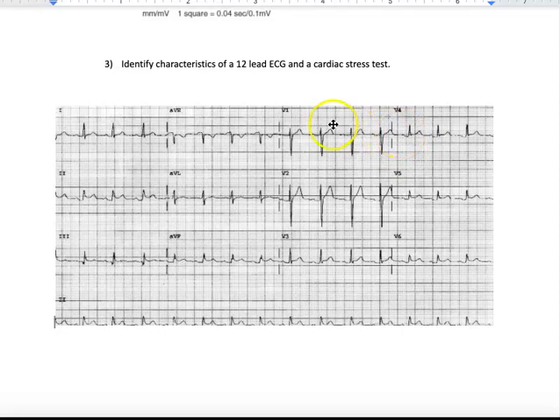it happens. So the one we just looked at with this nice PQRST, some windows look like that. But you look over here and notice how it looks almost upside down. That's because of the view, because of the window. Imagine, you've got a room and you put the heart in the middle and you have 12 different windows. If you stand at different windows, the heart's going to look different. That's the same kind of concept.